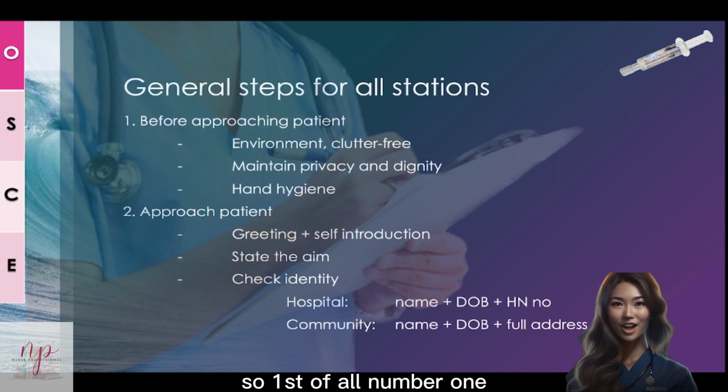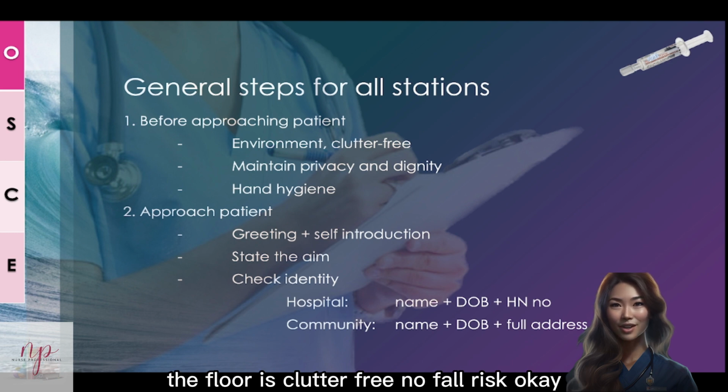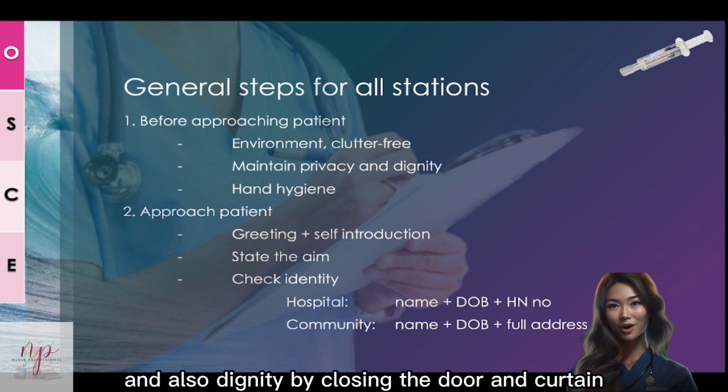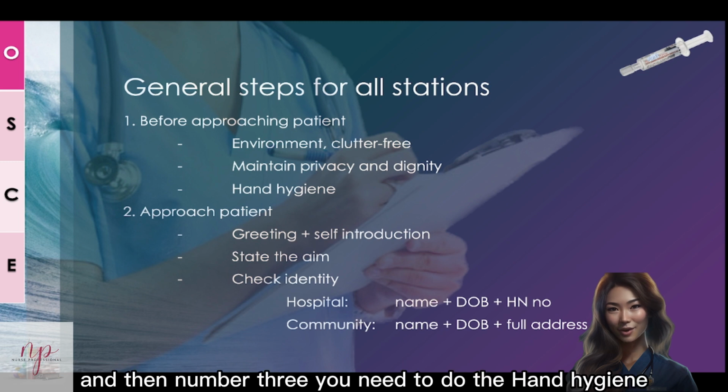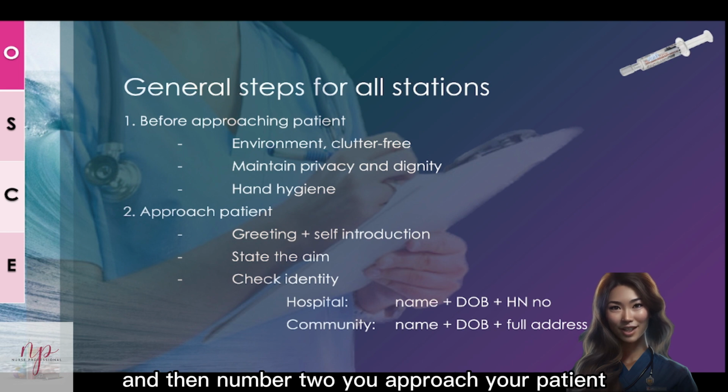First of all, before you approach your patients, you need to ensure the environment is clean, the floor is clutter-free, with no fall risk. Then you need to maintain privacy and dignity by closing the door and curtain. Then, you need to do hand hygiene. If it's the first time, remember to do the 7 steps. And then number two, you approach your patients.